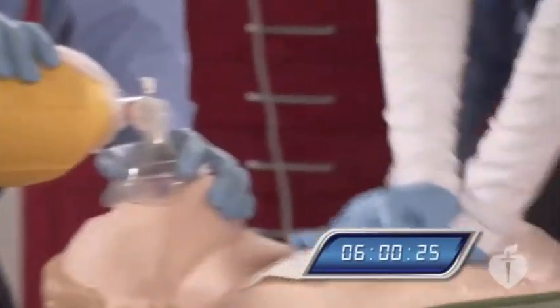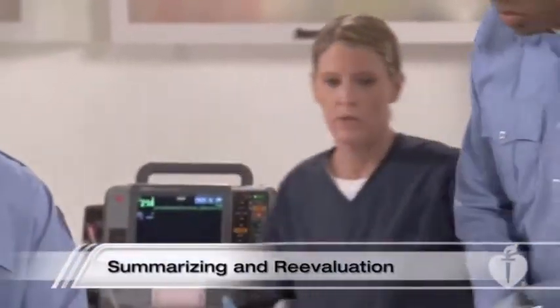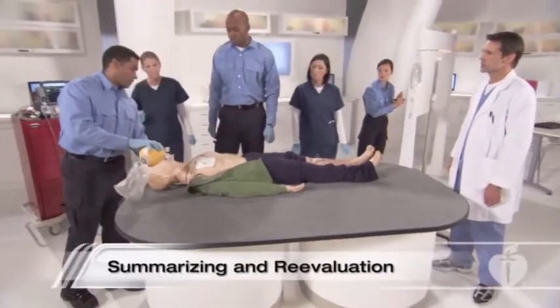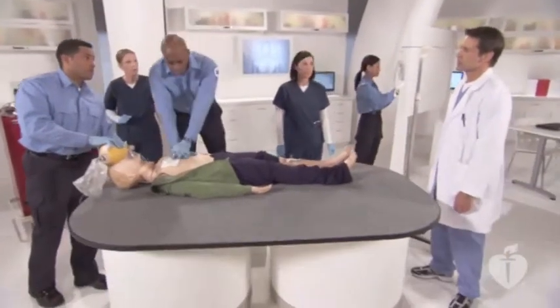2 minutes. Okay, let's analyze. Switch roles. Okay, the monitor shows sinus bradycardia. Do we have a pulse? I don't feel a pulse. Continue chest compressions. Continuing chest compressions.